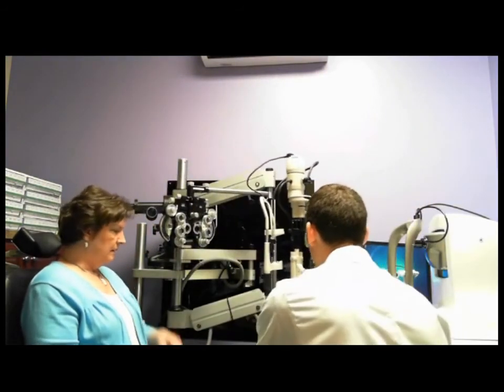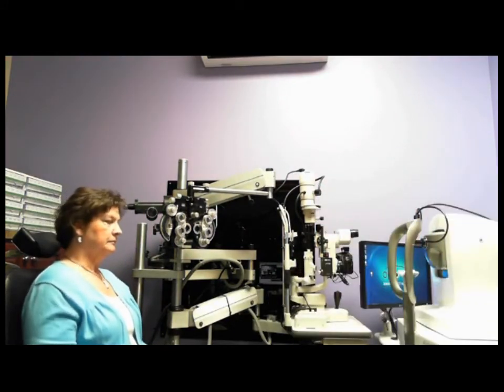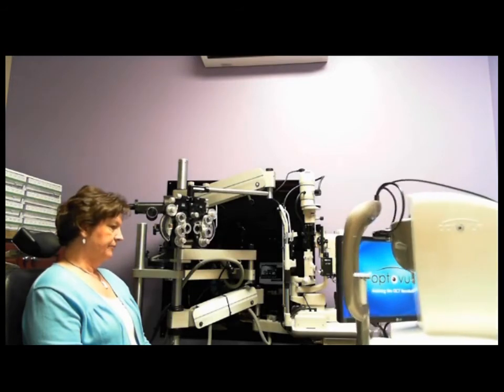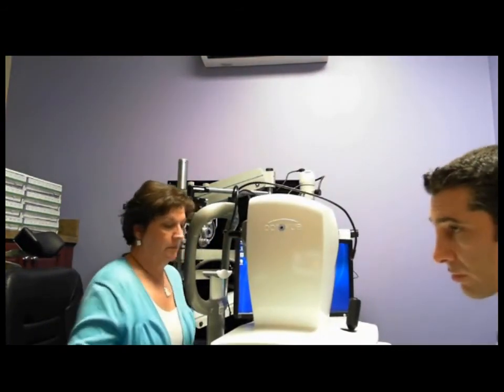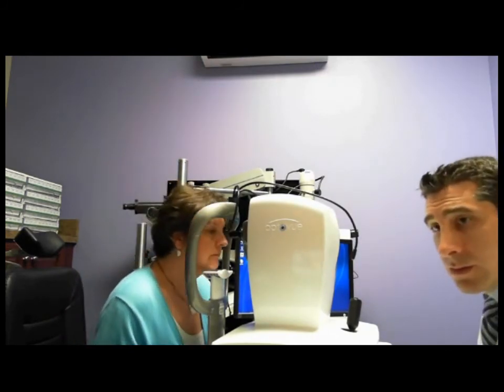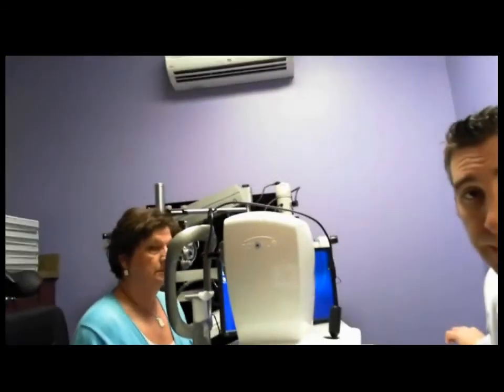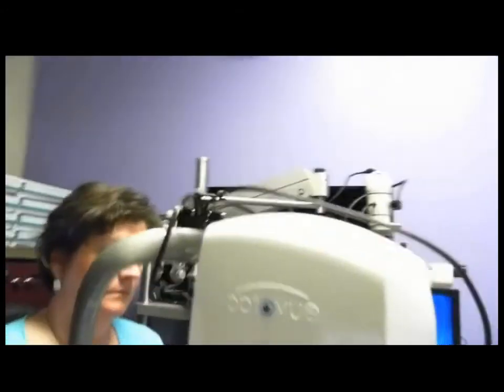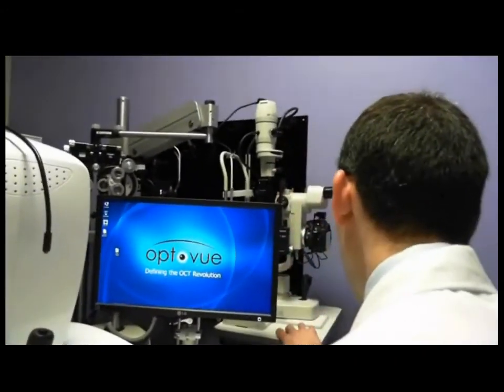Now, again, let's inspect with OCT to confirm what we did with the slit lamp. Okay, Elizabeth, can you take this camera and come around back here and focus on the screen so we can see.